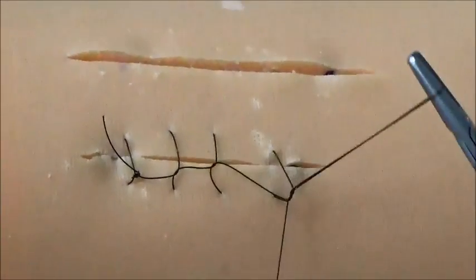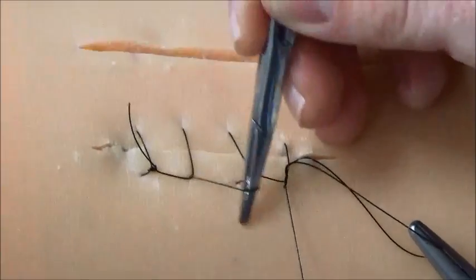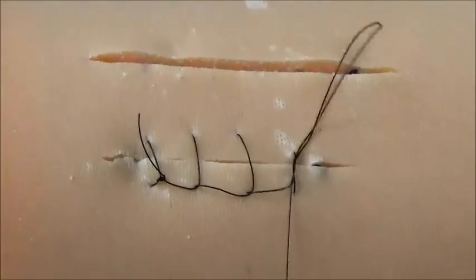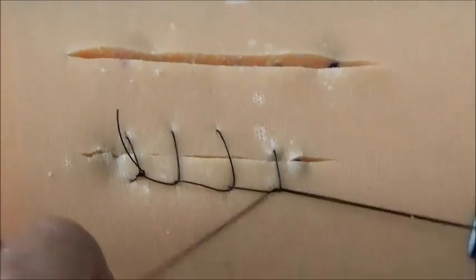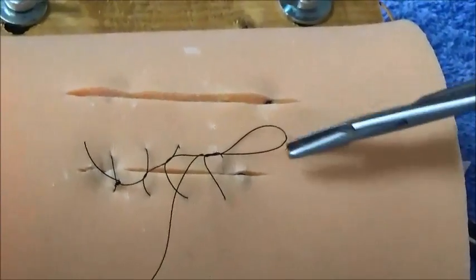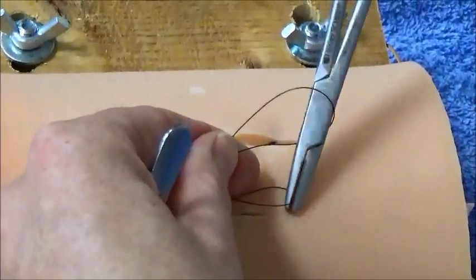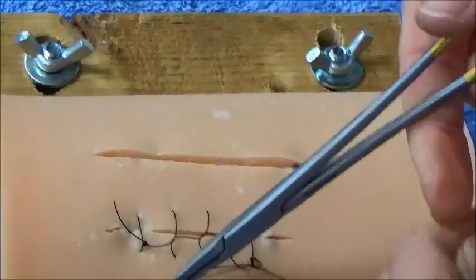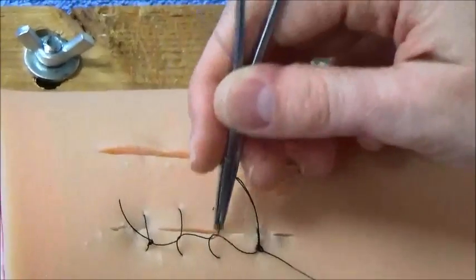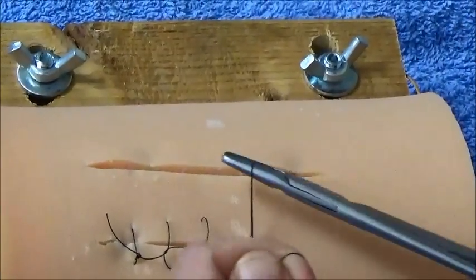So I'm going to tie to this loop, and as I do so, I'm going to make sure that this comes snug enough. So in this case, I needed a little help in doing that. Open my drivers, and I'm going to try to pull my knot down to the bottom of the suture line, at least when I get my second throw on. Nylon has memory, so it likes to go back to the shape it was in the packet of suture. So I'm going to snug it down and give it a little bit of encouragement in making it the shape that I want it to be.